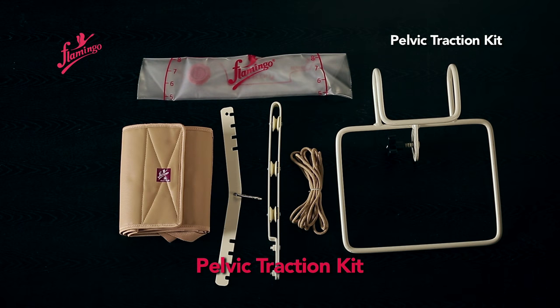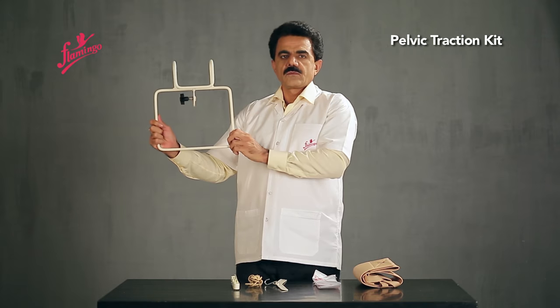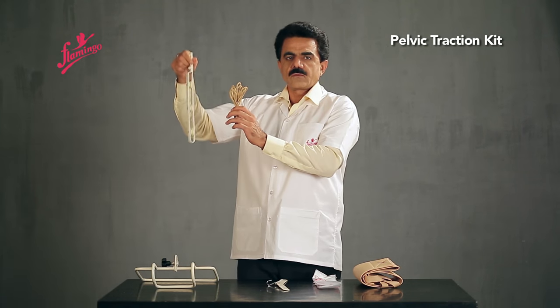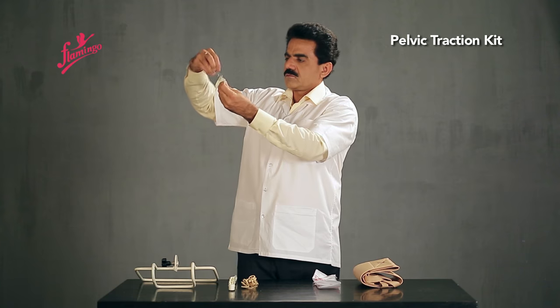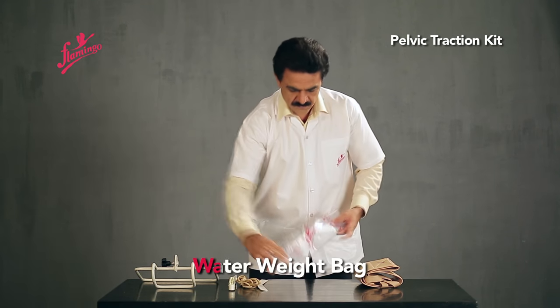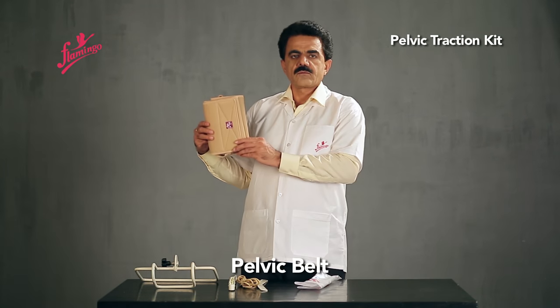Pelvic Traction Kit components: Traction Pulley Bracket, Traction Cord, Spreader Bar with Hook, Water Weight Bag, and Pelvic Belt.